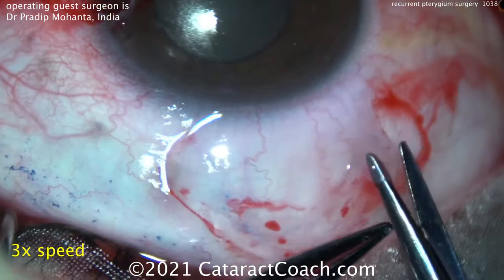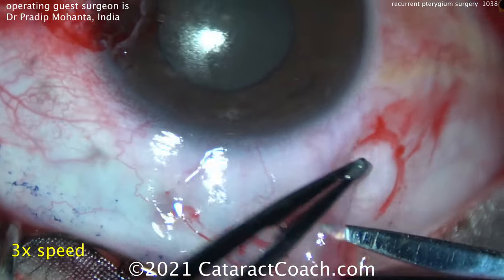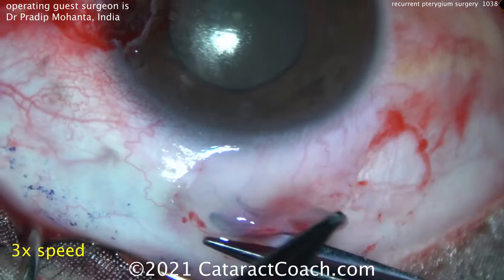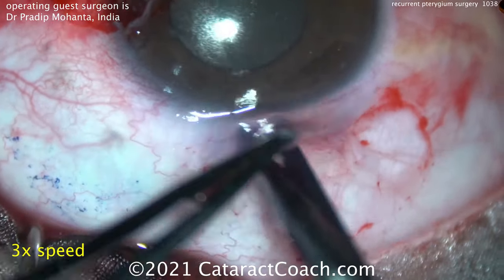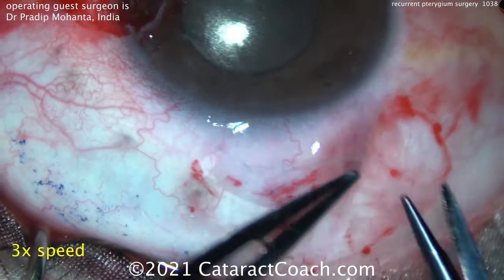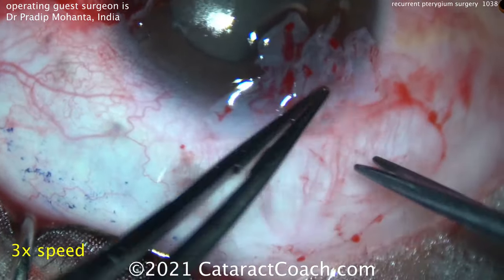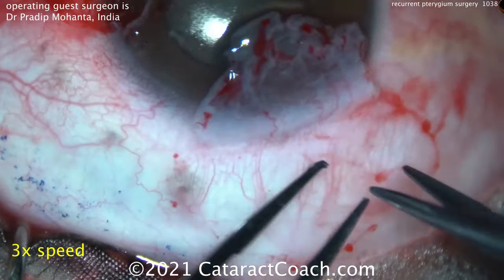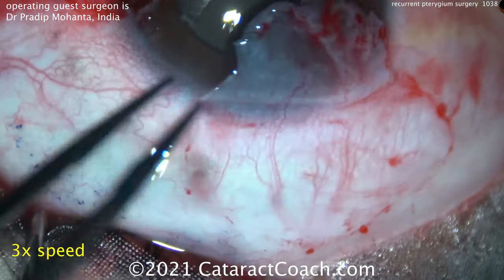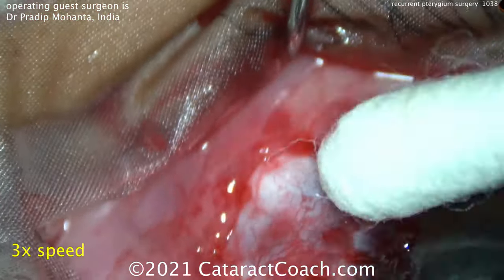Try not to damage the underlying Tenon's. If you take off just the conjunctiva and leave the bare Tenon's layer behind, the epithelium of the conjunctiva will close and grow over that with minimal scarring. The conjunctival area that you dissect — when you leave this superior part bare — it will grow back and re-epithelialize. There is the flap; flipping it over and getting a good dissection. The Tenon's is basically completely intact and you see the thin conjunctival layer.